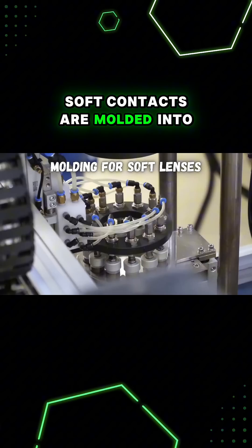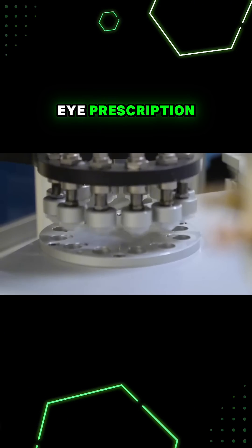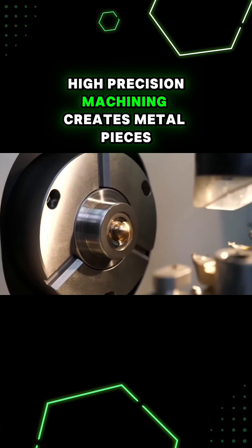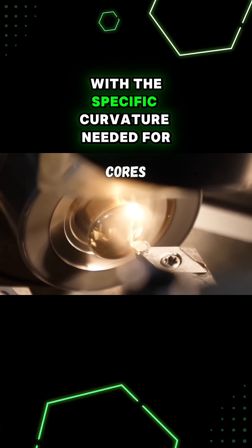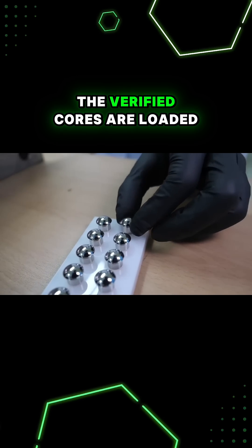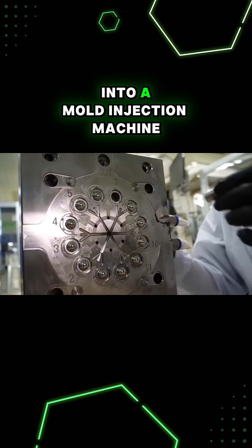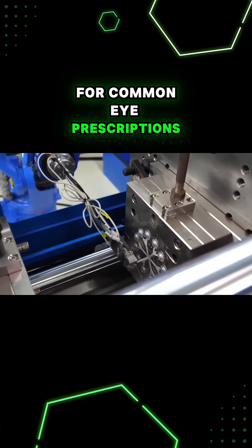Soft contacts are molded into the shape needed to correct for a certain eye prescription. High precision machining creates metal pieces called cores with the specific curvature needed for the contacts. The verified cores are loaded into a mold injection machine where they can mass produce millions of contacts for common eye prescriptions.